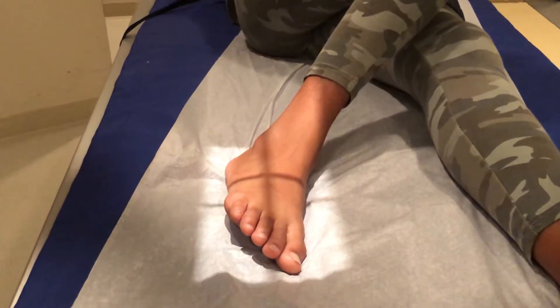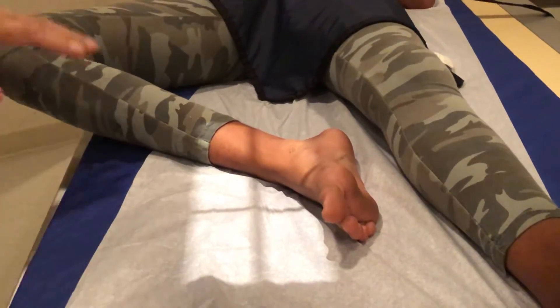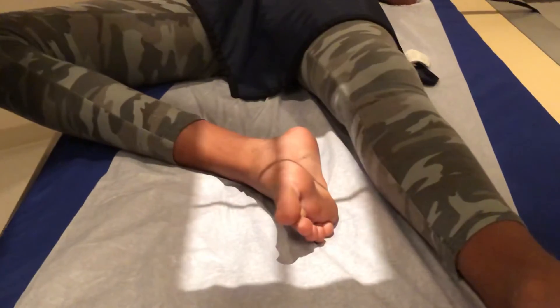The third one is going to be a lateral, and for that we're going to have the patient bring their leg all the way up this way, like that. Now you can have them turn over onto their right hip and bring the other leg across, or you can just have them bend their knee. So that's what we're going to do here.